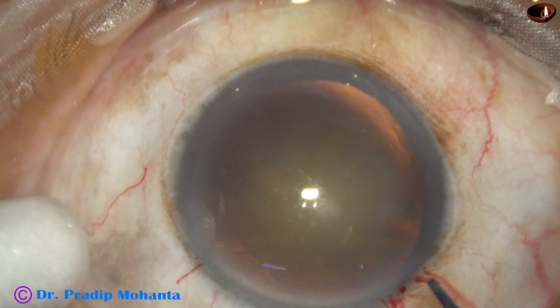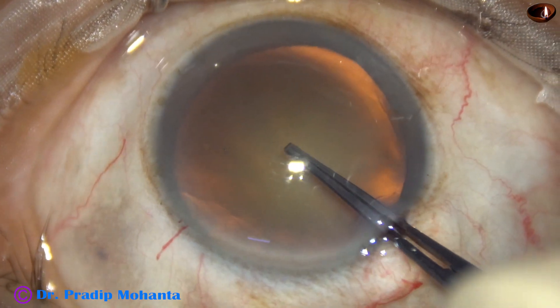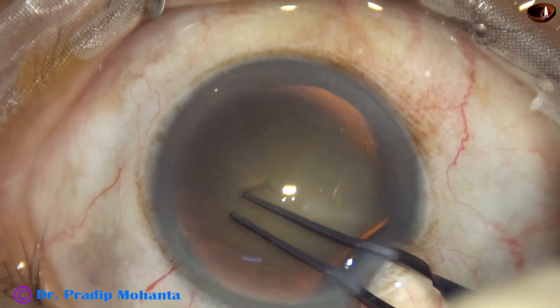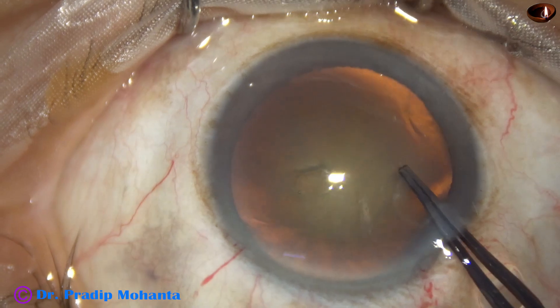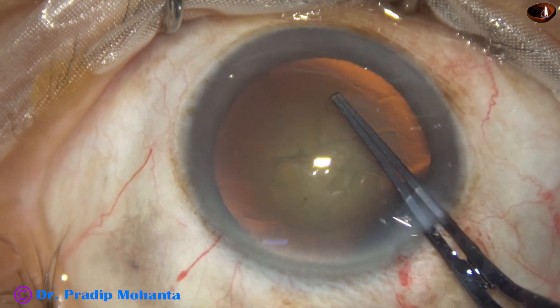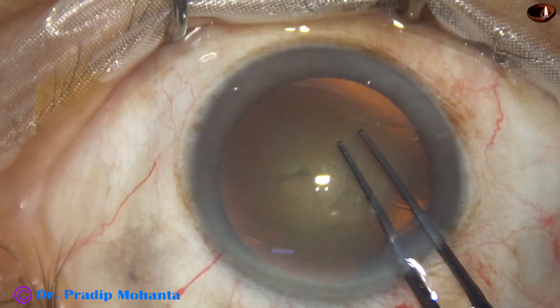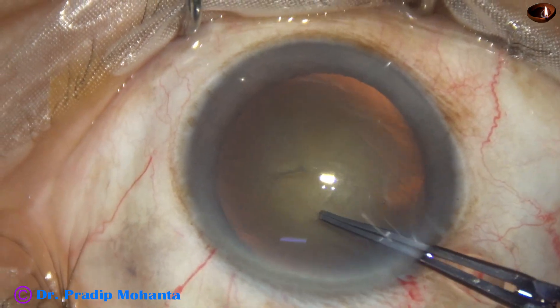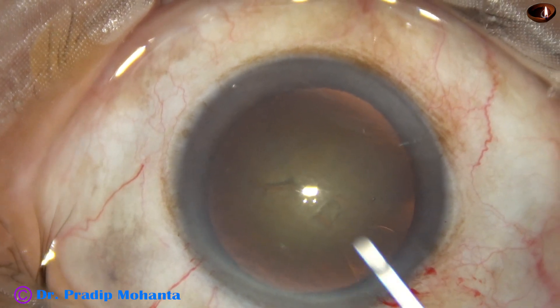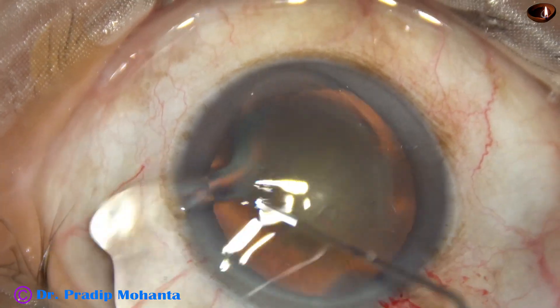A Utrata forceps is taken, the anterior capsule is punctured, a capsular tag is raised, and this capsular tag is guided anticlockwise all around to get an adequate size of about 5.5 mm.